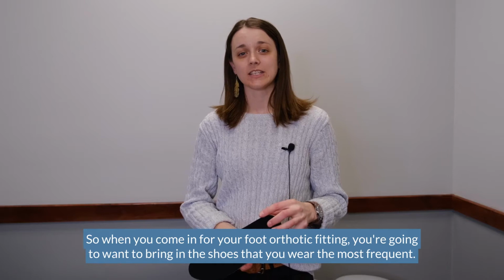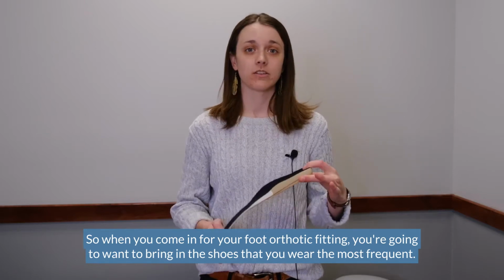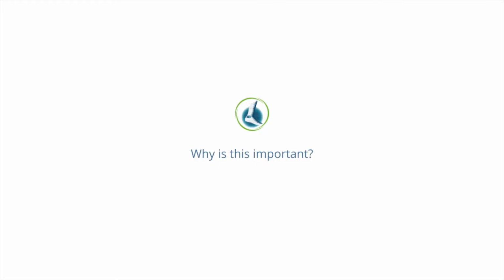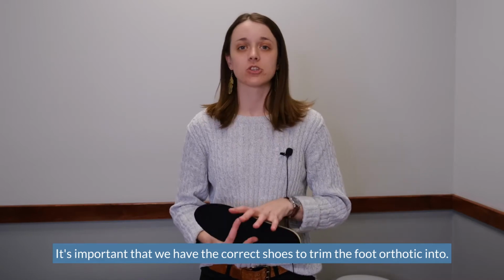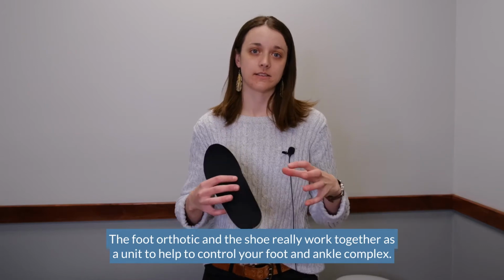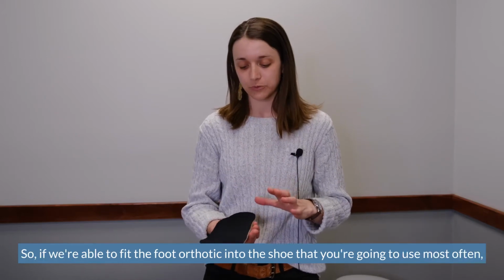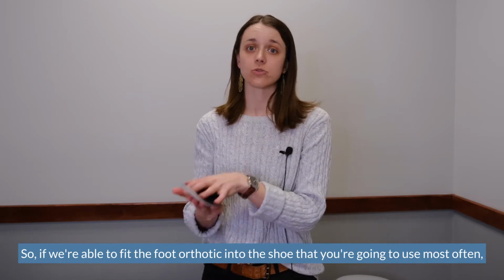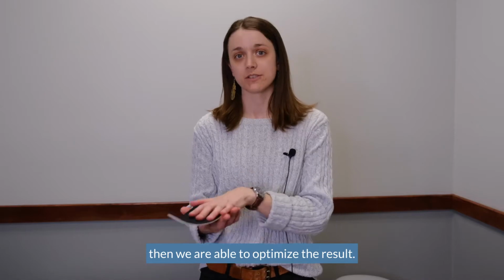So when you come in for your foot orthotic fitting, you're going to want to bring in the shoes that you wear the most frequently. It's important that we have the correct shoes to trim the foot orthotic into. The foot orthotic and the shoe really work together as a unit to help control your foot and ankle complex. So if we're able to fit the foot orthotic into the shoe that you're going to use most often, then we are able to optimize the results.